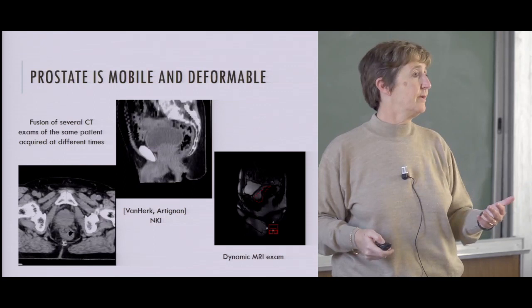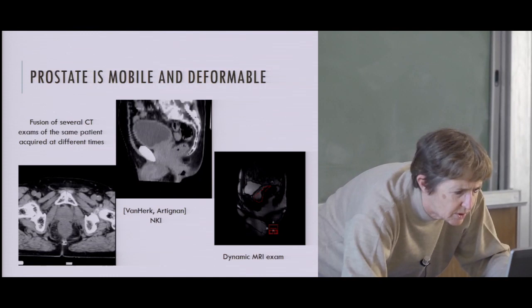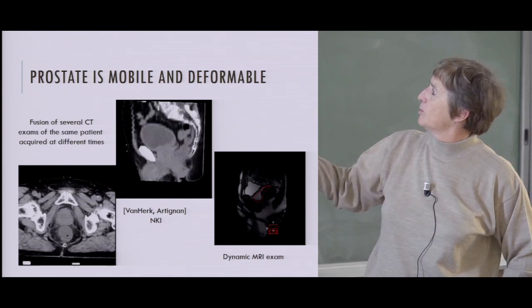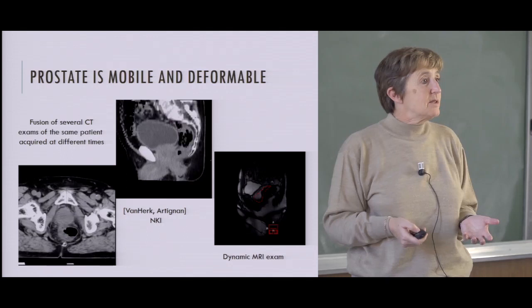And you can even see, if you look at this, it's an MRI sequence and the prostate is here. It's a dynamic sequence and you even see that during breathing the prostate naturally moves, and so it's very difficult. If you plan something, you have to consider that to be able to adapt to these motions.